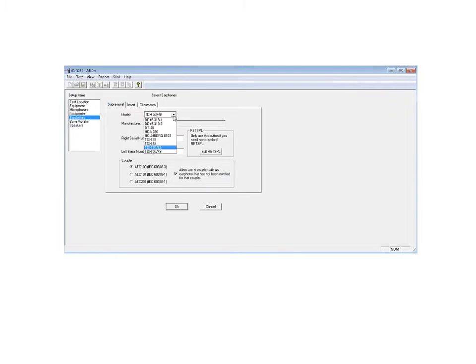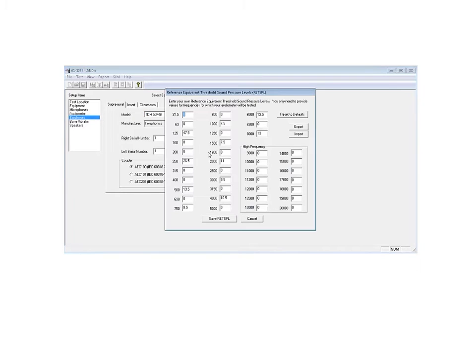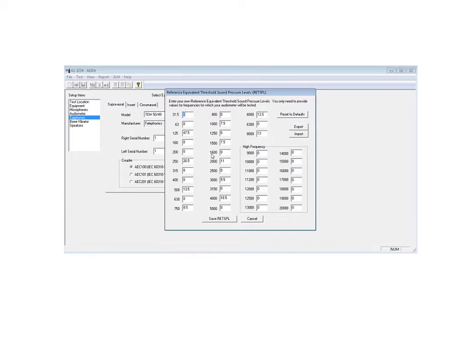You can see a number of different models that we can bring in corrections for. There's also different couplers that you can use to test the earphone. We mentioned briefly the R-E-T-S-P-L. You can actually, if you have a unique earphone that you want to try, go in and change those reference equivalent threshold sound pressure level numbers away from the standard number to match maybe a special test item.